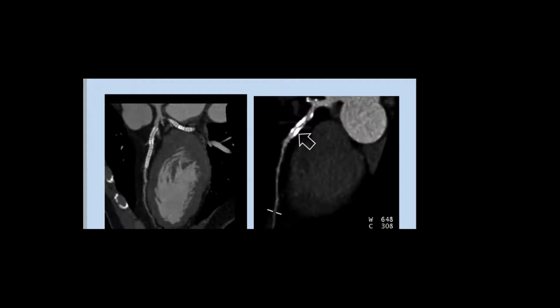The problem of cardiac CT, which limits its diagnostic accuracy, especially with stents and calcium, is the so-called blooming artifact or volume averaging artifact. When you have a dense structure like a stent or calcium, it blooms. It appears bigger than it actually is, and it might conceal or hide the lumen. So you won't see the lumen well, and the stent or calcium will appear larger than it actually is. This is called blooming artifact.